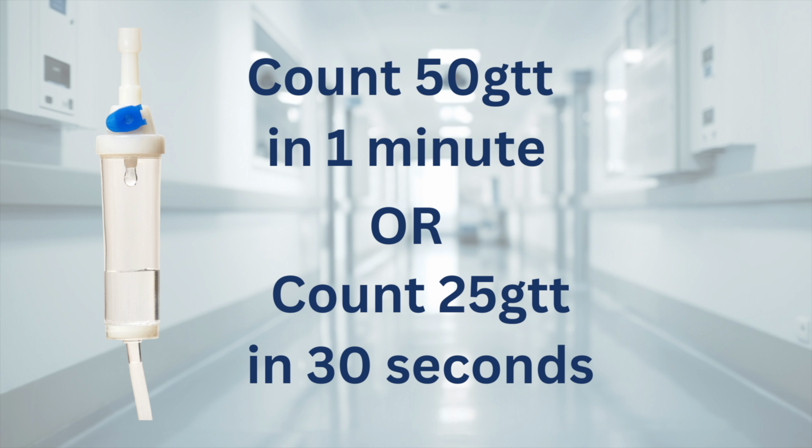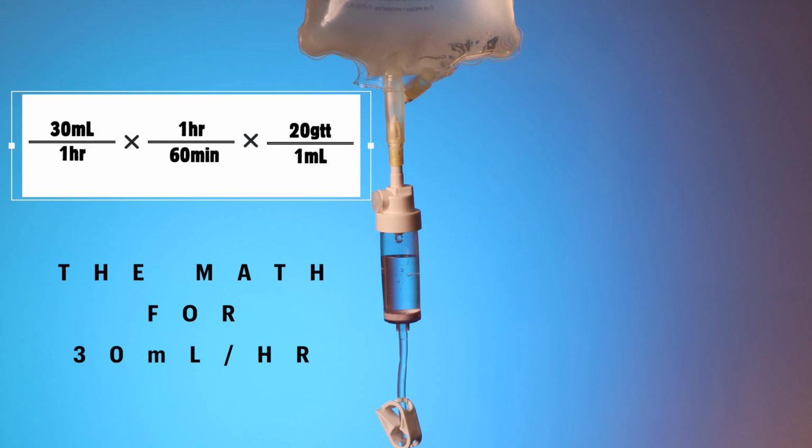Now we are going to demonstrate an infusion from start to finish with the corresponding math calculations. This is our first drip rate of 30 mLs per hour. You can see that the math is on the screen here.